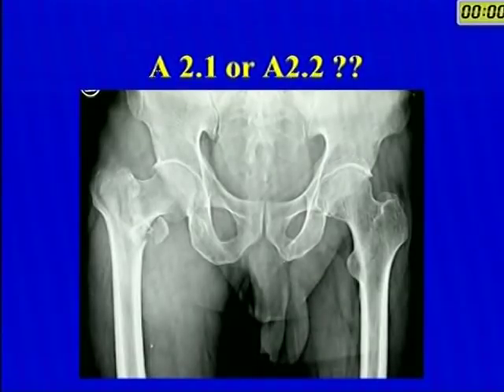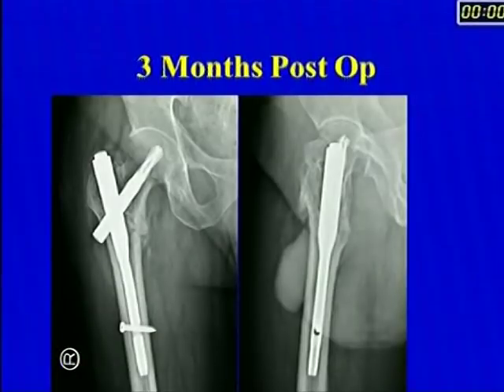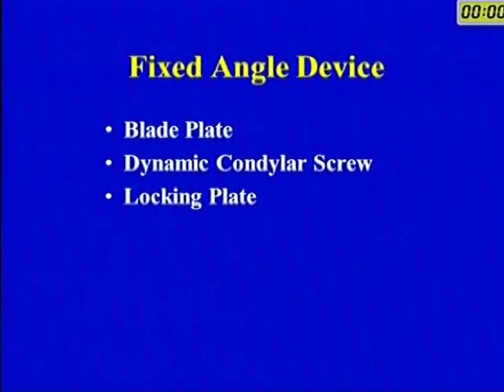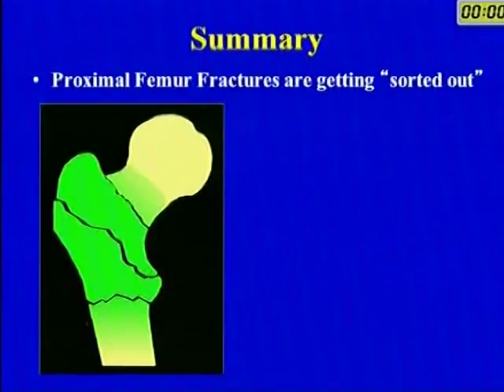Again, a similar case treated with an intramedullary device heals. These look fairly simple, but you have to look at it carefully to decide whether this is a 2.1 or a 2.2. There are some fractures, especially those which have a neck fracture like this, which may not be amenable to nailing, and they may require some kind of a fixed angle device, probably a blade plate. Nowadays there is a lot of talk of locking plates, but even they have their own problems. So at the moment, for fractures which have a neck component, probably a blade plate is a good option.